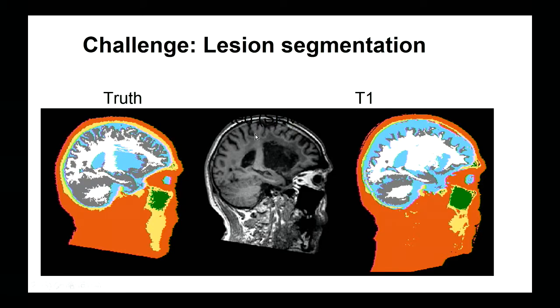But when working in clinical context, we often have abnormalities which are derived from lesions or tumors, and these models are often not flexible enough to account for that. For example, here in the middle we have a T1 weighted MRI, and we have a lesion from a stroke. So there was necrosis here in the middle, and the tissue was filled with cerebrospinal fluid.